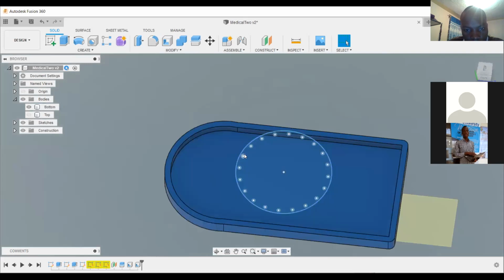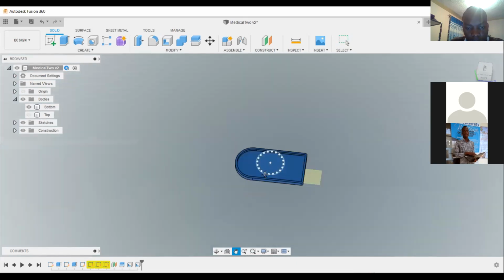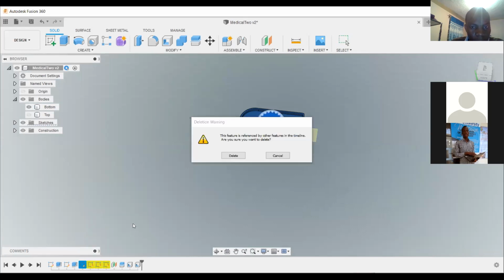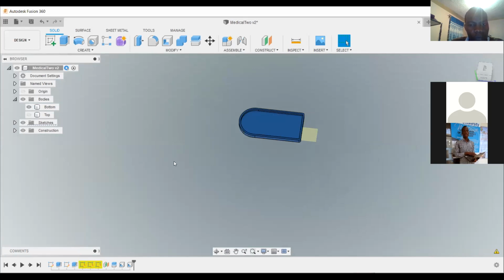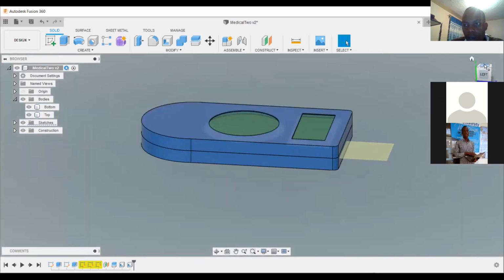So this one zinatuletea shida. I didn't draw them on a face. So if you have a problem like this, you have to fix it. You can go back to where you did have a problem. Okay, so utapata ni hapa. And then you can delete. You can delete that. So we'll have to redraw it again. That feature, we have to draw it again.